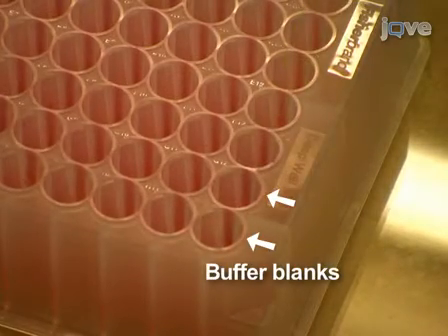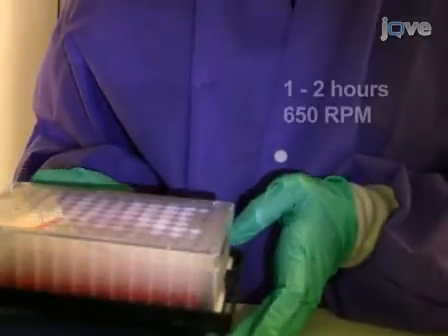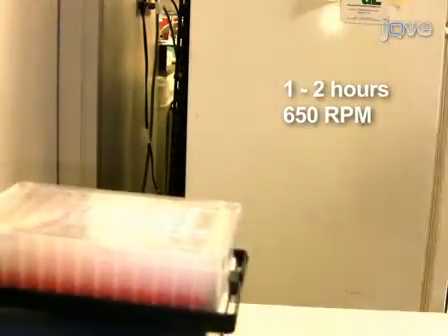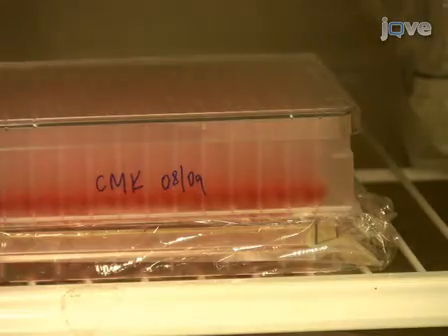Before storing the master plate for future use, it is extensively shaken for 1 to 2 hours on a rotator platform at 650 rpm. The serum is stable for at least one month or longer at 4°C, and the plate can be sealed with parafilm to prevent evaporation if it will be stored.